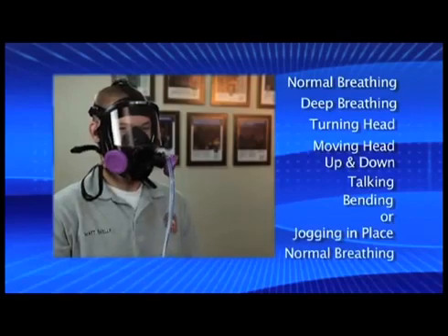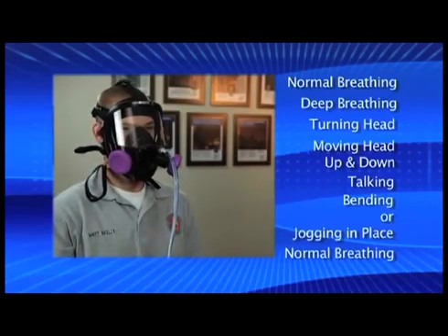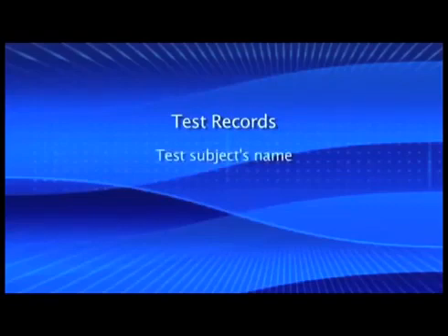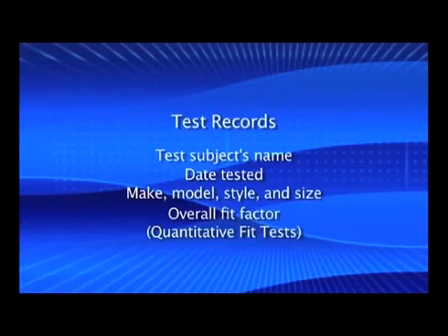Finally, normal breathing again. When the test is completed, question the subject about the comfort of the respirator. If it's acceptably comfortable, the test is complete. If not, retest with another respirator model. Keep records on file of successful tests. The records must contain the test subject's name, date tested, respirator make, model, style, and size, and, when performing quantitative fit tests, the overall fit factor.